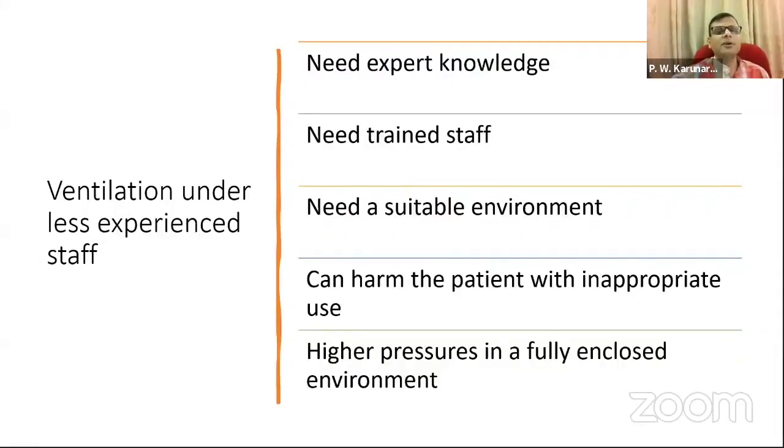But there is some kind of change, I would say, in ventilation under less experienced staff, because once you learn about ventilation, you realize that you need some kind of expert knowledge to save a patient. You can ventilate, but to save a patient you need expert knowledge, and you need trained staff, including nurses and doctors, and you need a suitable ICU environment, where you have all the facilities to monitor the patient and then do blood gases, things like that.